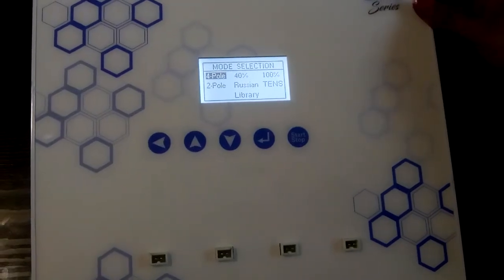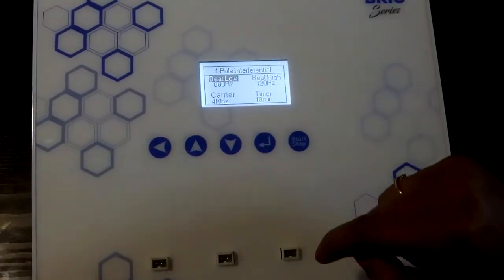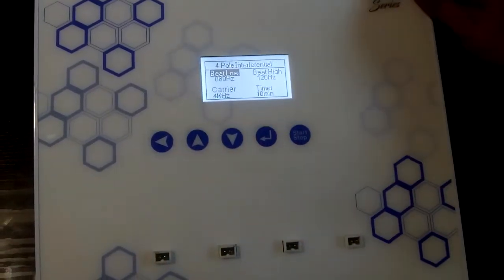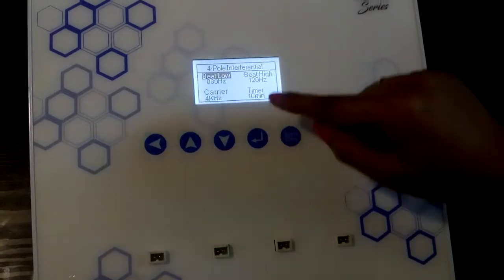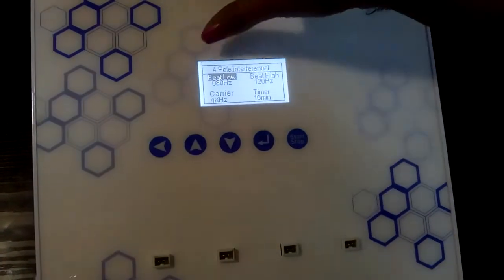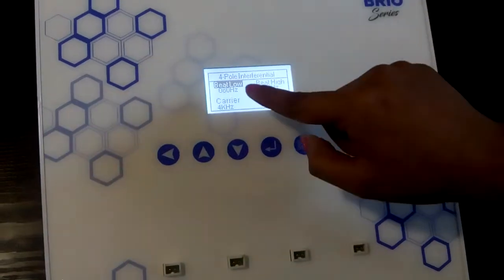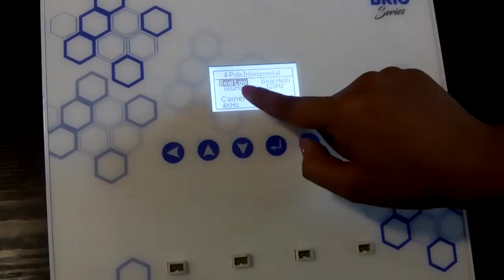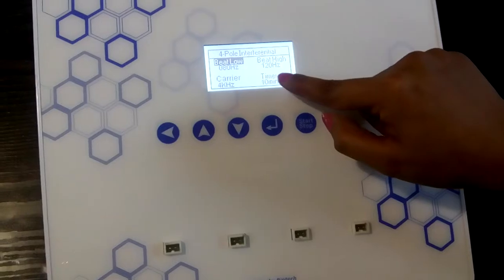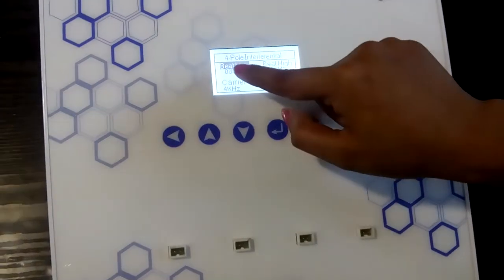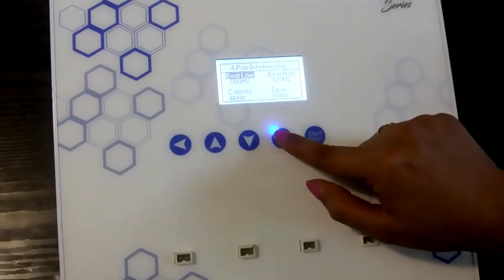Now let us set the 4-pole parameters. To set the 4-pole parameters, press the enter button. Once we are in the 4-pole interferential setup screen, you can see the options of beat low, beat high, carrier frequency, and timer. To change the beat low frequency, press the enter button once.